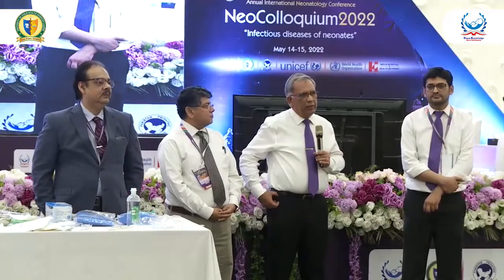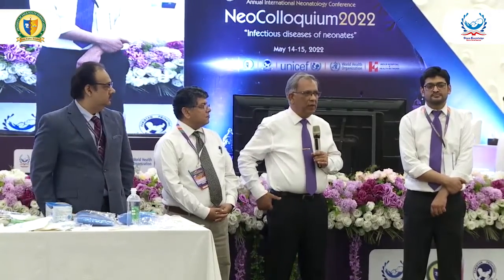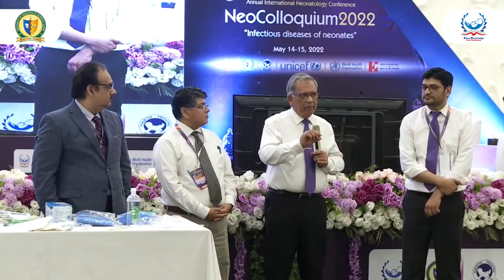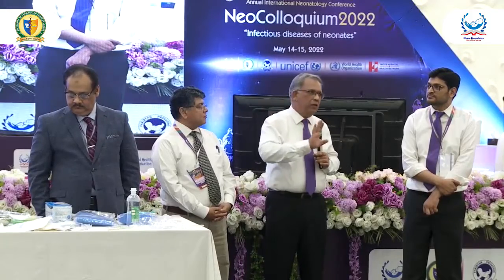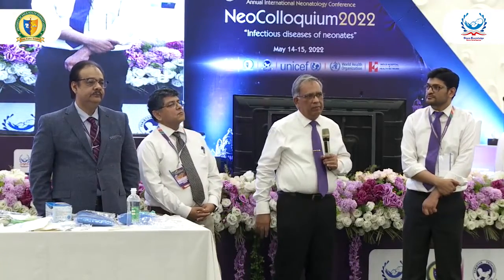About 10 years back, when we started putting these long lines in the babies, of course, our staff wasn't that much trained at that time. So the first problem we encountered was blockage. When they were giving some fluid and changing to another fluid, they would stop the first fluid. They would take a few minutes to prepare another fluid and attach it. And during that period, it was clogged. So it has to be continuous.